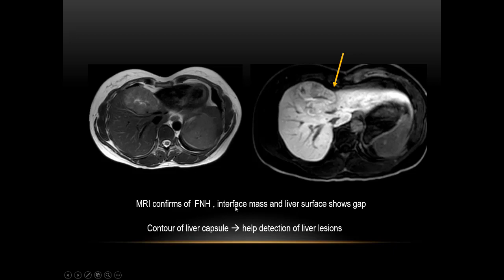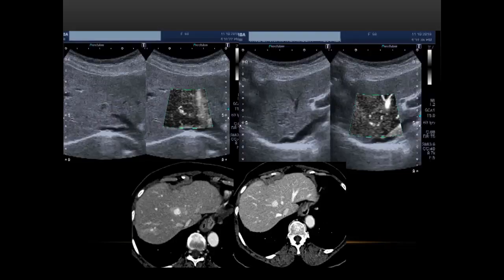And ultrasound at the first place, on B-mode, can easily miss it. But SMI can detect this one, to make sure and confirm there's a mass and go to further investigation. Also, the flow pattern of the nodule gives more information.